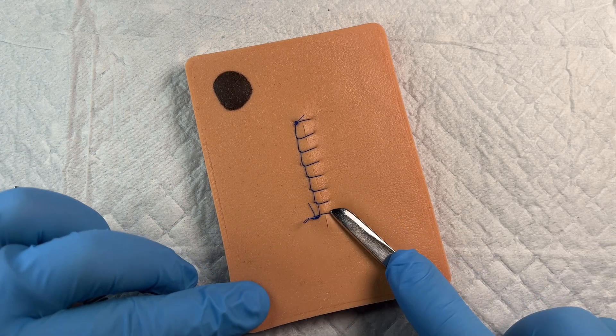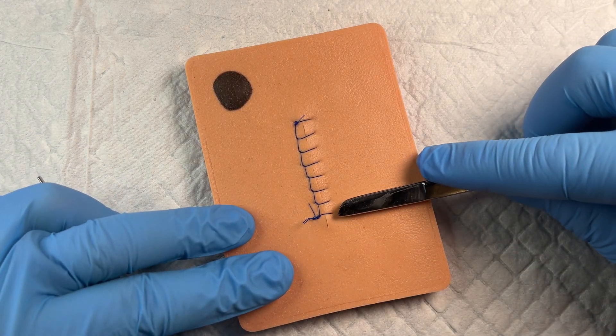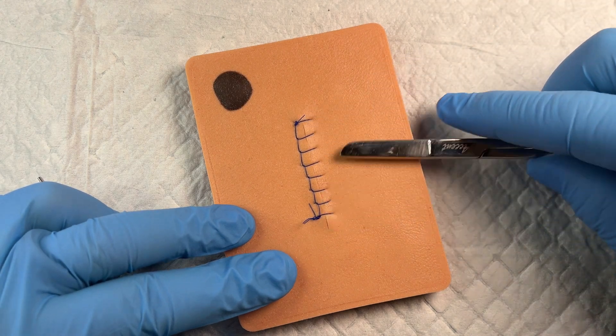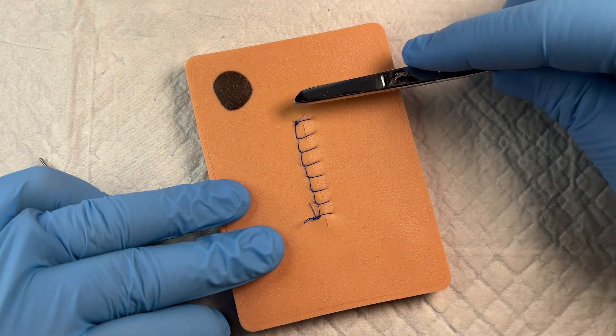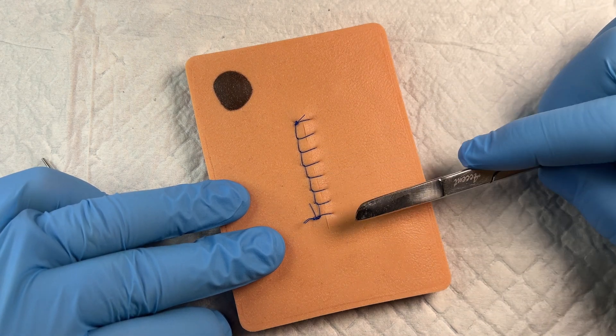All right, in this quick video, I'm going to talk about best practices when it comes to removing sutures that are of a running, locking nature like this. If you have a continuous suture that needs to be removed, how do you remove it best?